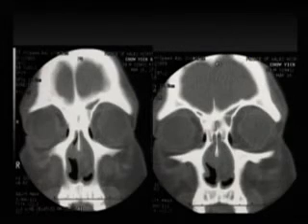Like in these patients, you can see going from front to back. In the very first cut, you can see that the patient has nasal polyps. He has had previous surgery. That's why the turbinate is actually gone, the inferior turbinate.